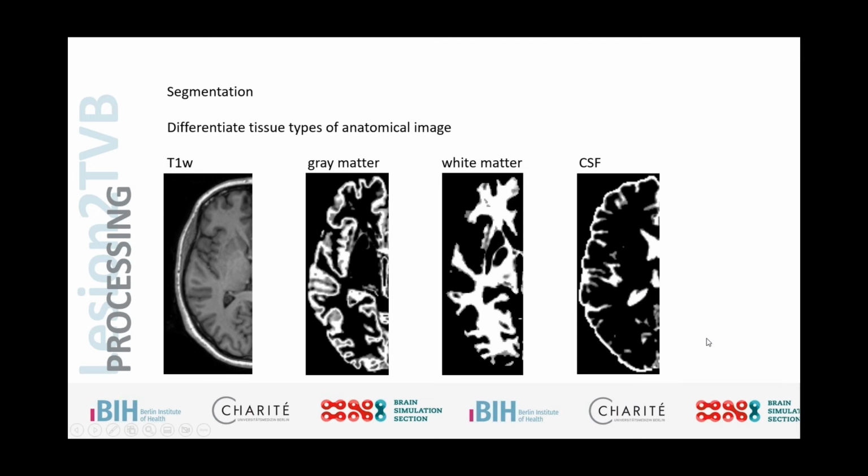Another one that is also important in our case, that we'll get to a little bit later as well, is the pathological tissue, which is just a category to include any types of pathology that you want to define, even if they are represented in different intensity values and different properties, etc. This is one way to try to segment the lesion inside of the actual T1 images, which is an ongoing research field, and currently, unfortunately, there's no real way around the radiologist or neuroradiologist actually looking at such data and manually segmenting the lesion. So also in our case, this is required.